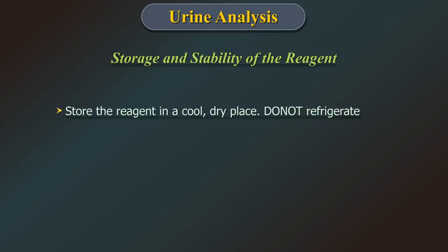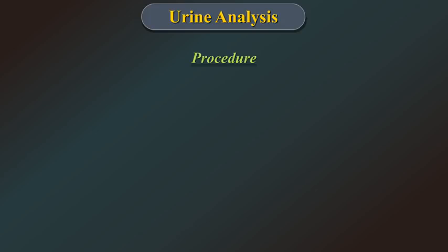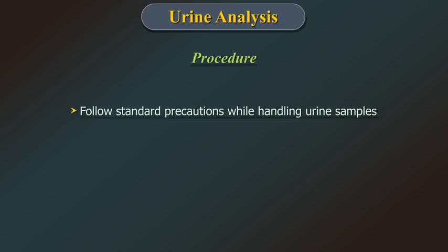Store the reagents in a cool, dry place. Do not refrigerate. Keep out of direct sunlight and protect against ambient moisture and heat. Procedure. Follow standard precautions while handling urine samples.